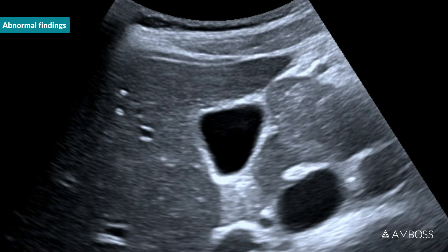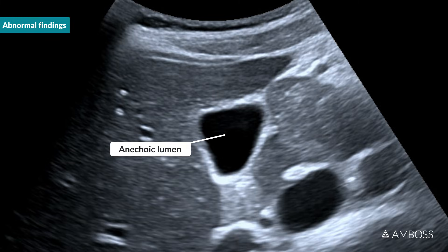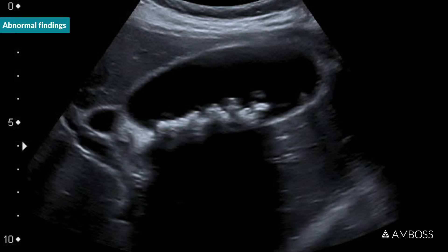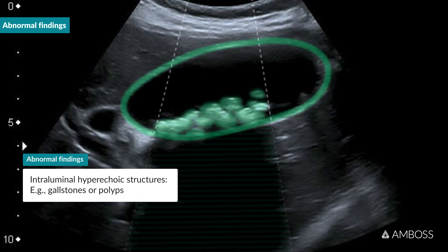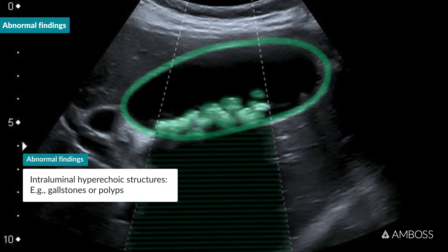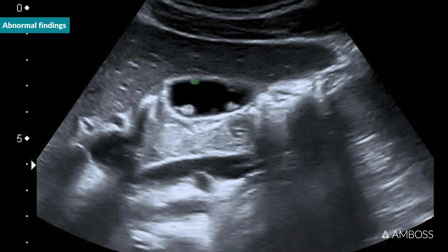Because the gallbladder is filled with fluid, the lumen is normally anechoic. Hyperechoic structures within the lumen may represent gallstones or pathologies of the gallbladder wall, such as polyps. Gallstones typically result in acoustic shadowing and may move around within the gallbladder if the patient changes position. Polyps are outgrowths of the wall and therefore not mobile, and they also do not usually have an acoustic shadow.